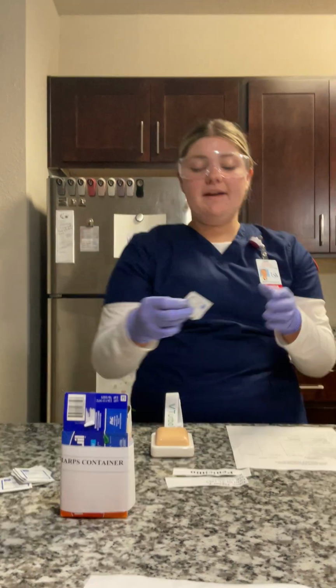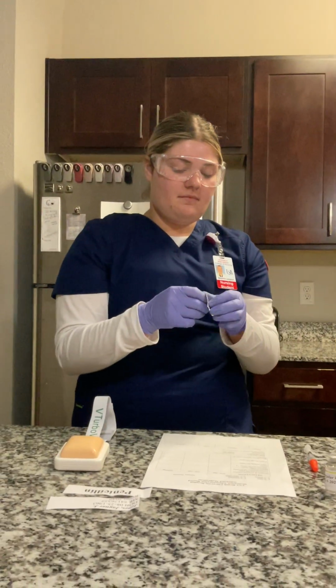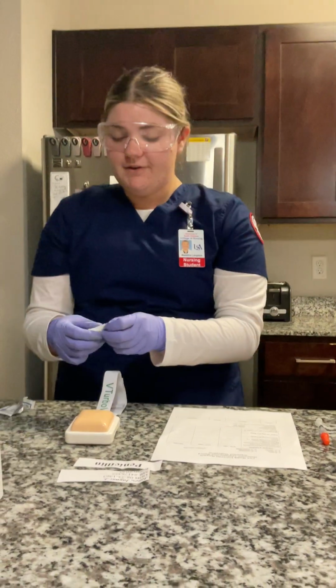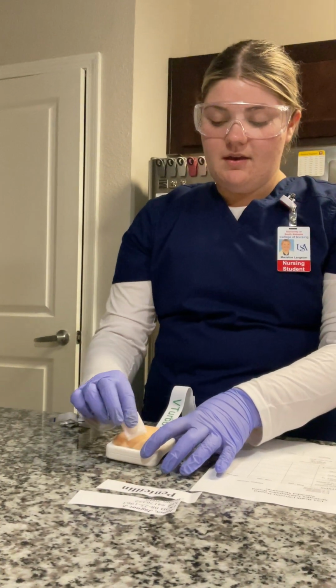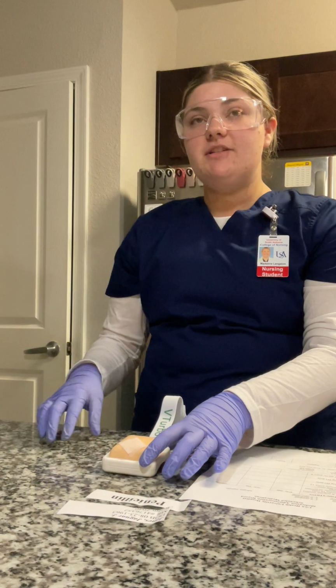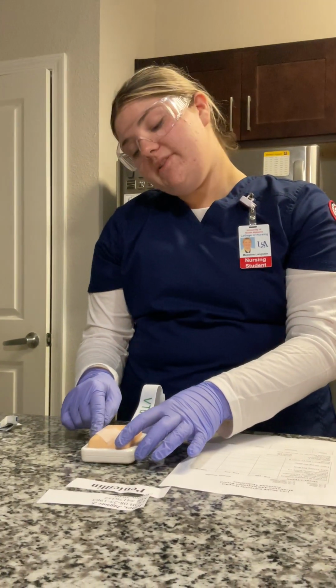And now I'm going to clean my injection site. So I'm going to do circular motions. And I'm going to place my alcohol pad in the location that I'm going to inject, and I would assess for any bruising on the skin.